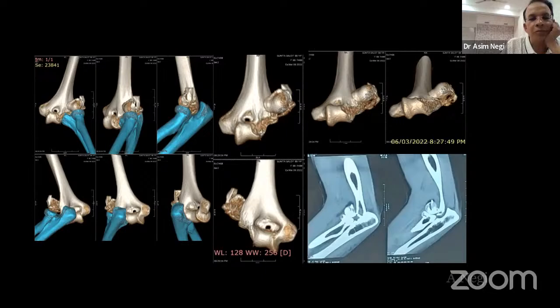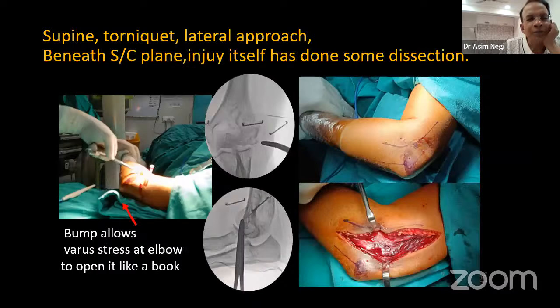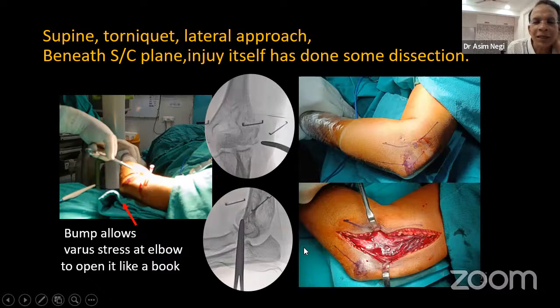Yeah. So again, a supine position, pneumatic tourniquet, the same extensile lateral approach beneath the subcutaneous plane. The injury itself has done a lot of dissection there. The moment you take skin and subcutaneous tissue and open this fascia, there is huge soft tissue damage, which itself has dissected. So don't remove soft tissue from the bony pieces. First, try to understand which piece is there. And this bump beneath the medial side allows a varus stress at the elbow to open it like a book. As Sangeet showed you in one of his cases, that he released the lateral epicondyle, LUCL complex, and opened the whole elbow like a book. So here the injury has done that.